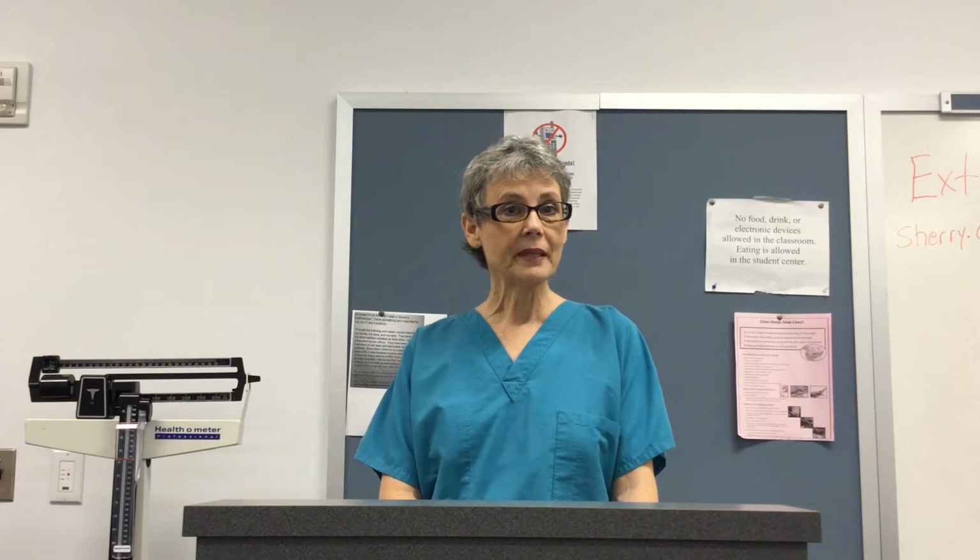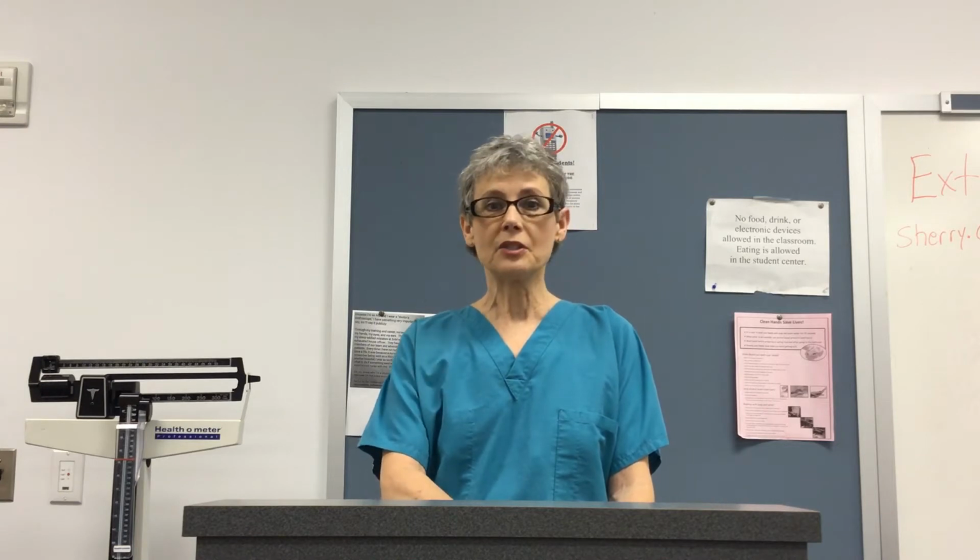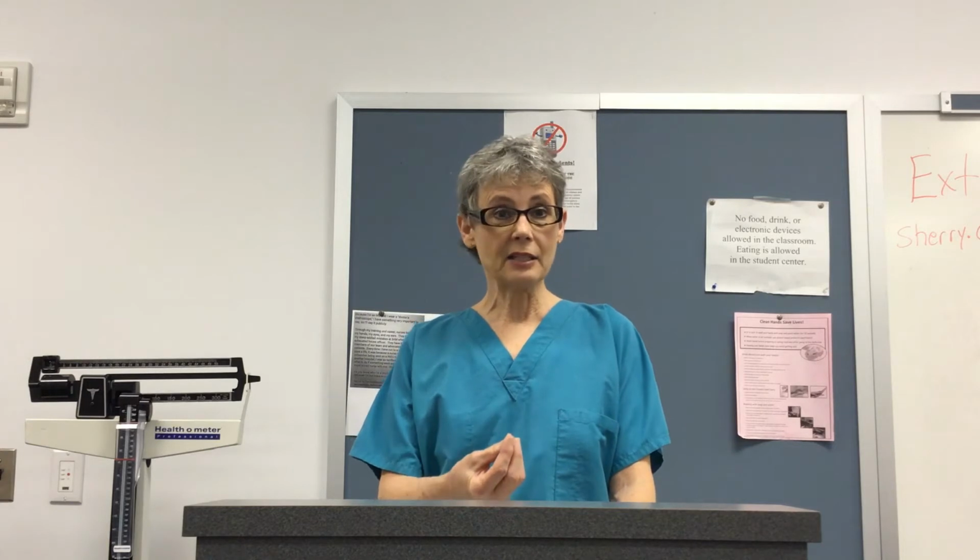Remember we were talking about having an IV piggyback? So that would be an example of something that would be intermittent. The doctor has ordered a particular time frame, like every 6 hours, every 8 hours. So much of this antibiotic needs to be given to the patient. And then when it has completely infused, you would disconnect that from the patient and just leave the tubing in the room until time for the next bag of antibiotic. So that's an example of intermittent.